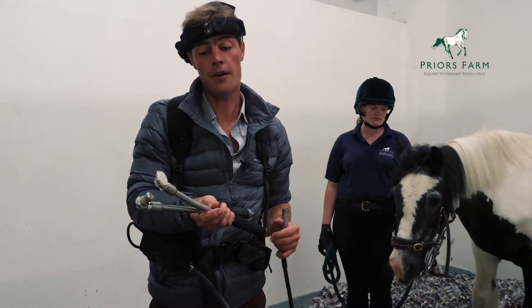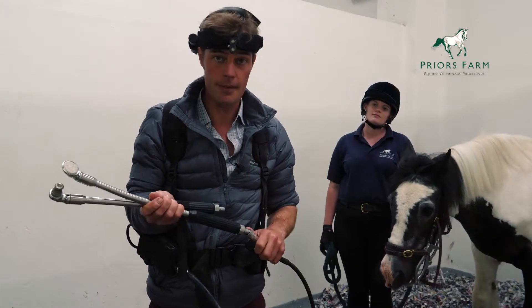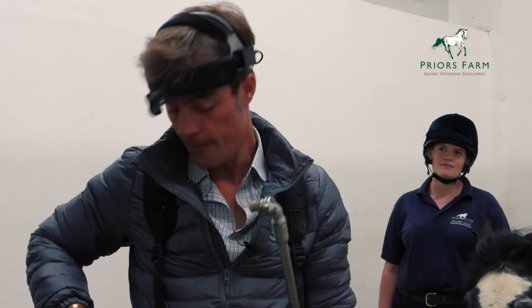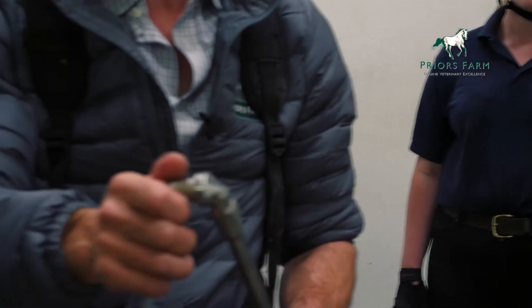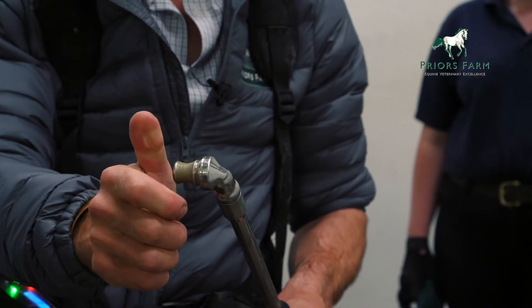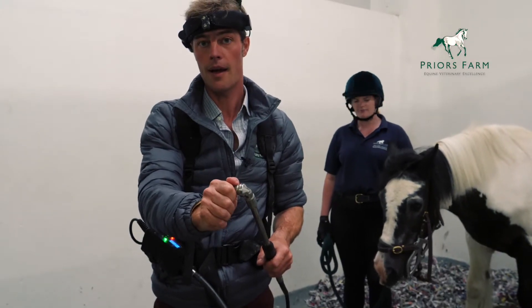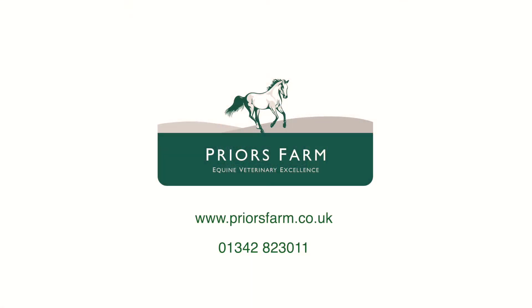It is also much quicker, which means that the horse's mouth is not kept open for as long. And it's not as hard physical work as it used to be, which enables us to do more teeth more effectively. I'm just going to turn this on so you can actually see how quiet this piece of equipment is. It makes very little noise and it's also incredibly safe — I can actually stop that burr with my own bare hand and it doesn't cause any pain at all. So it's incredibly safe for the horse.